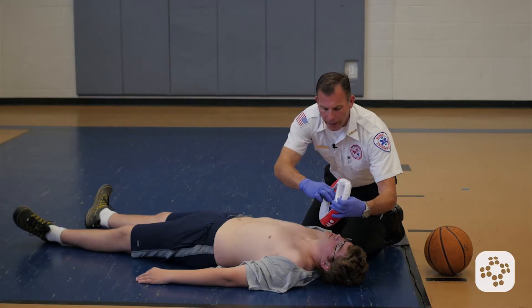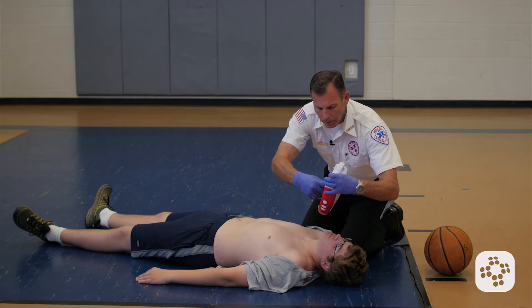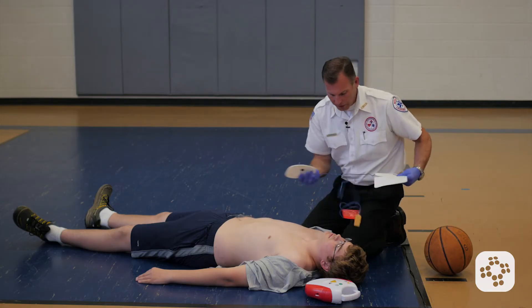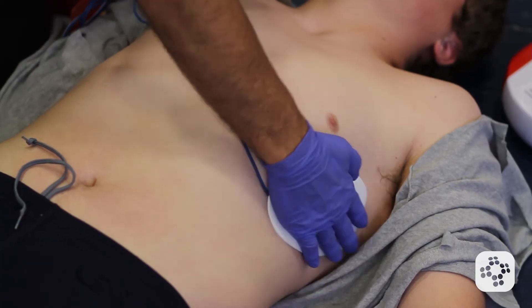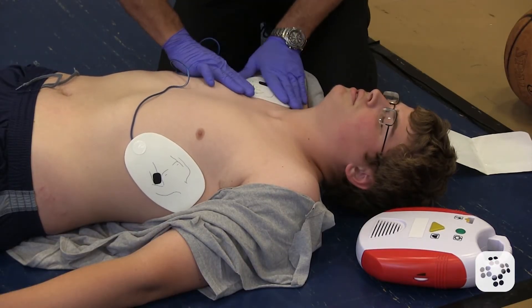It tells me to attach the pads and plug in the connectors, so I'm going to work on that. If I open this up, I can see exactly the way these are supposed to go. One goes here and one goes here, just like it shows right on the pads.